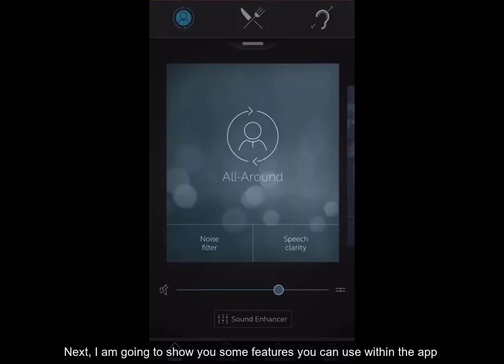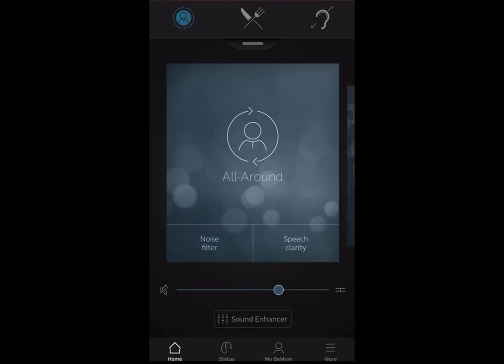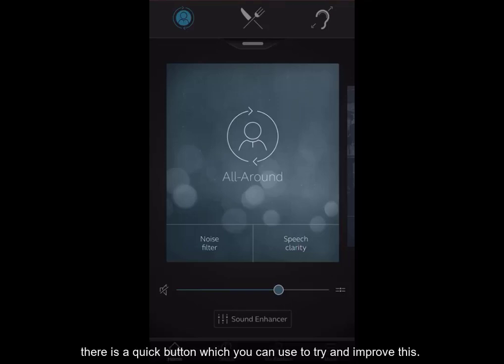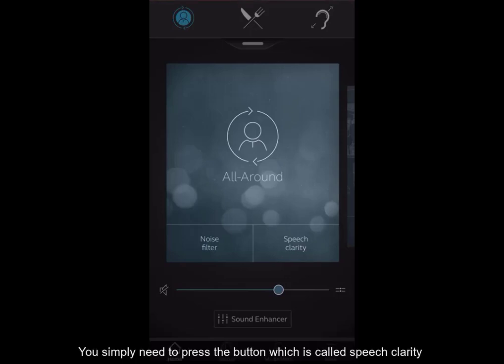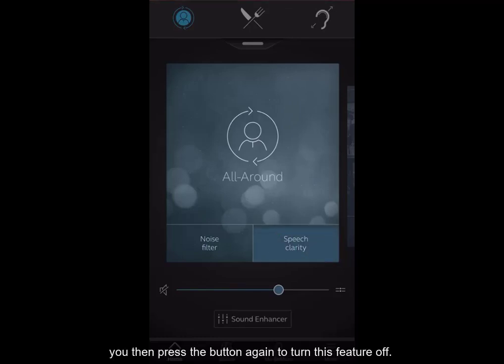I'm going to show you some features you can use within the app to try and help if you are in an environment where you do not feel you are hearing well. If you are somewhere and you are struggling with the clarity of speech, there is a quick button which you can use to try and improve this. You simply need to press the button which is called speech clarity. This will turn the feature on, and you then press the button again to turn this feature off.